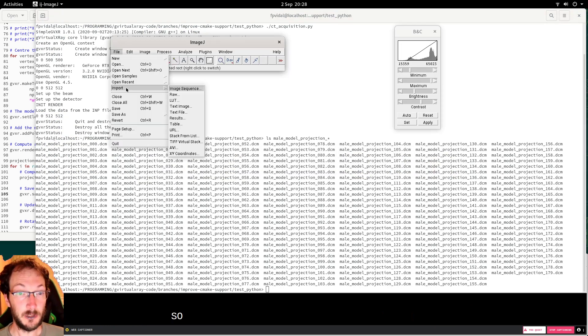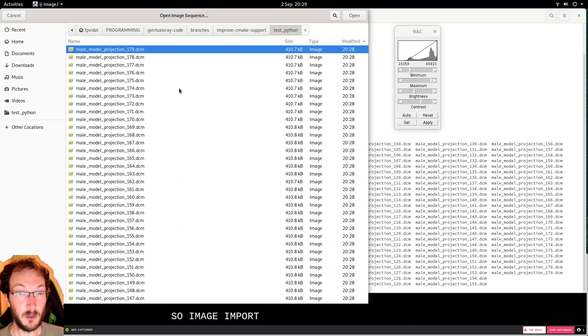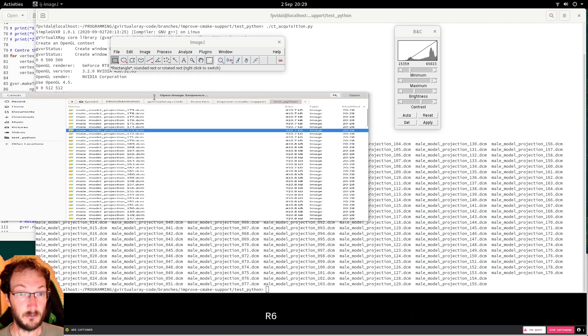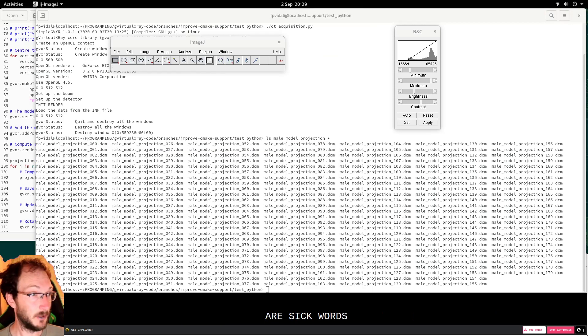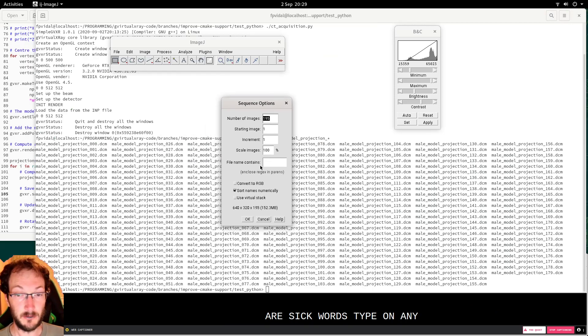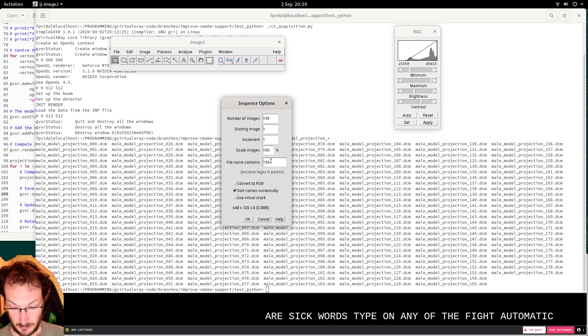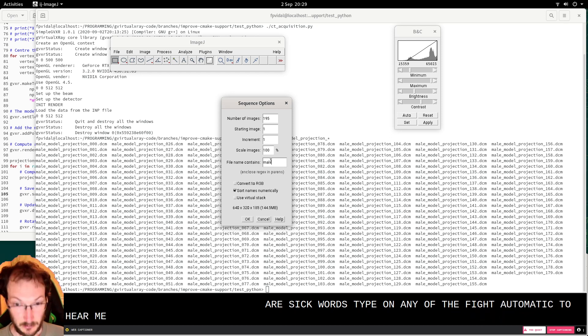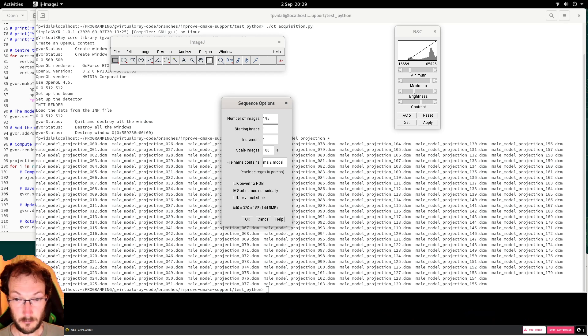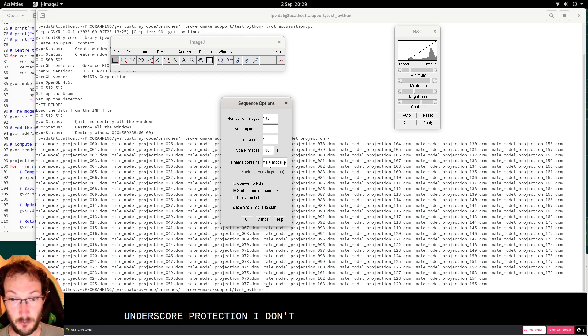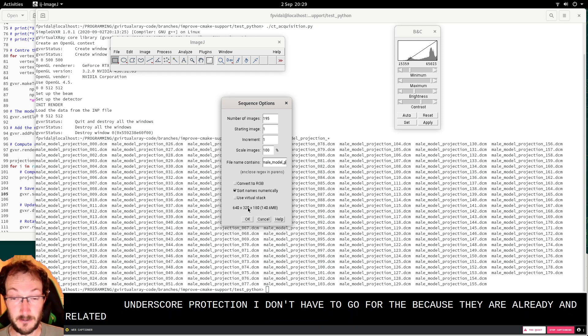Image import, file sequence, type on any of the files, it doesn't matter. So here, model projection underscore. I don't have to go further because there are already 180 files. Perfect.